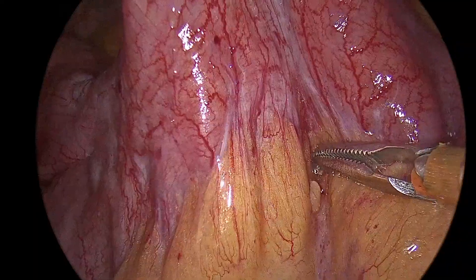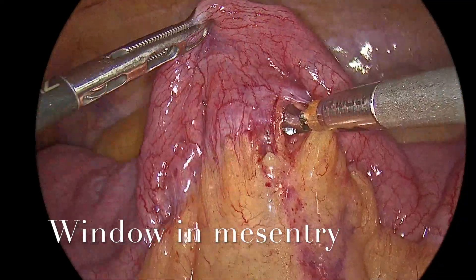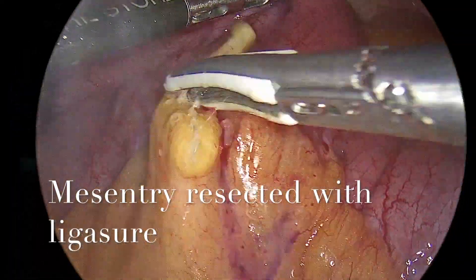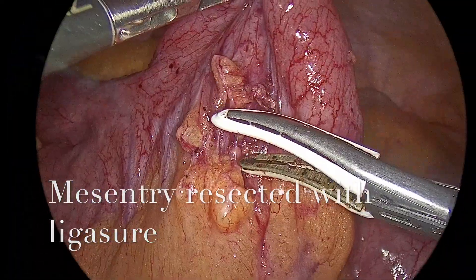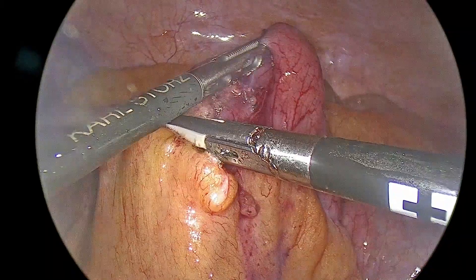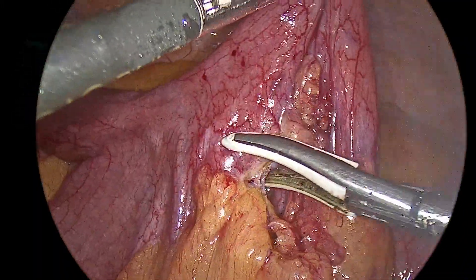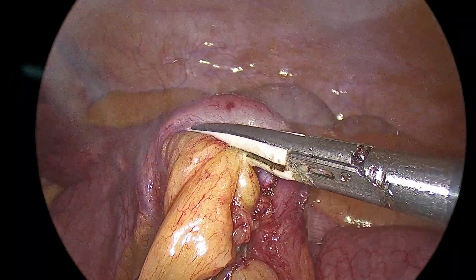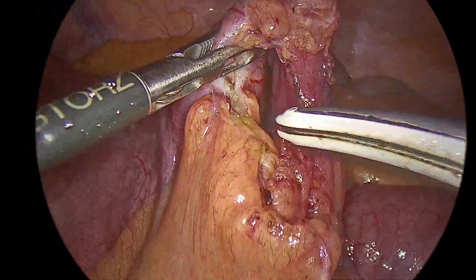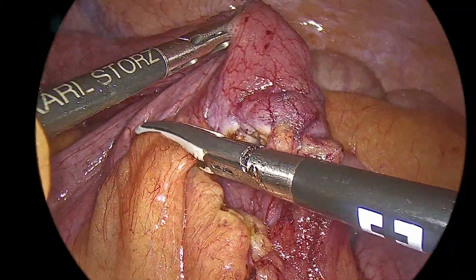First, we create a window at the resection points — both distal and proximal. Using a bipolar energy device such as a LigaSure, we divide the mesentery of the ileum, baring the ileum from one point to the point distal to the diverticulum, dividing the vascularity and mesentery completely, making sure we achieve absolute hemostasis with no bleeding. Once complete mobilization is done, we will resect the whole segment.